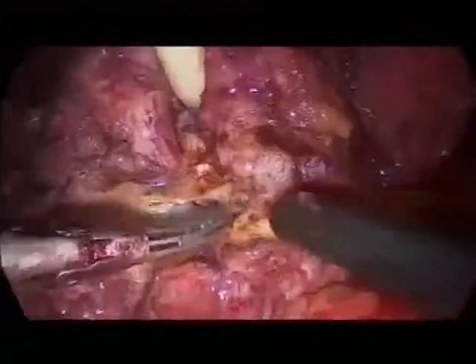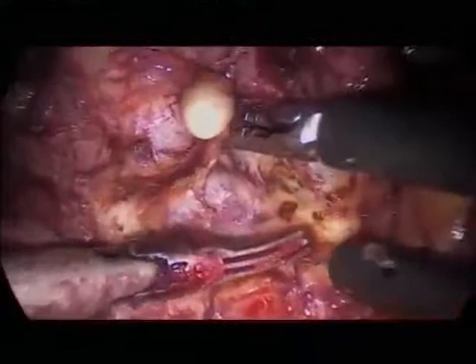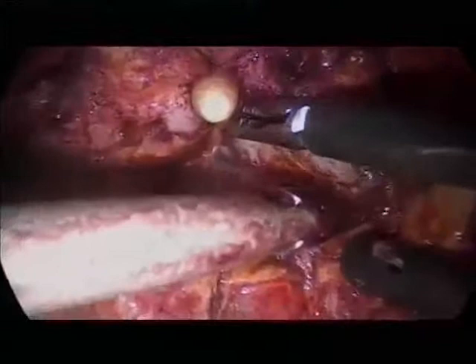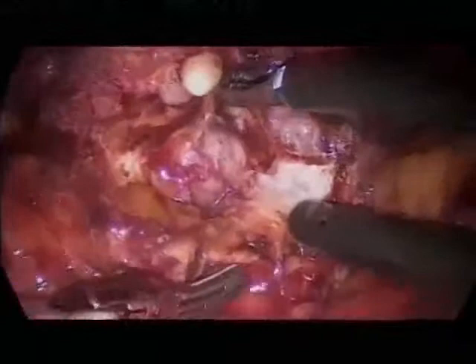Okay, there's the vas. What about this muscle described by Sechin? What did we used to call this structure? You come to the anterior layer of Denonvilliers' fascia, and Guillenot has published that this is a muscle. I always call it Sechin's muscle. I think this is also interesting for orientation. Yeah, I don't know. It depends. I think you don't need it.